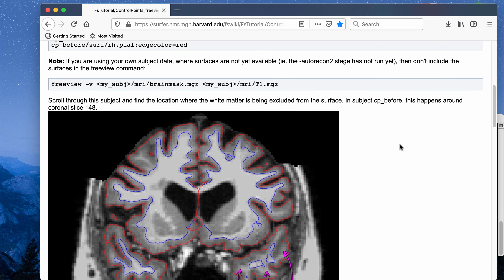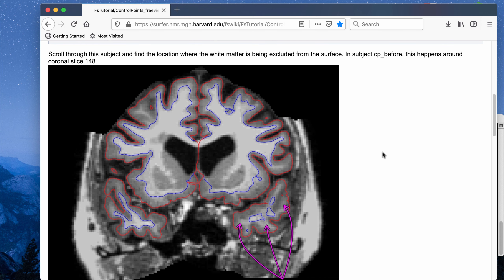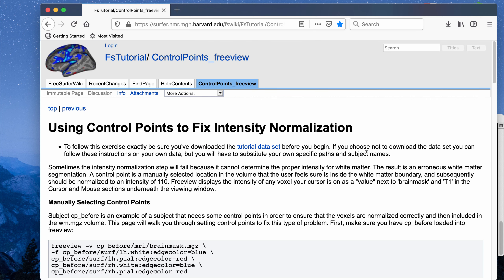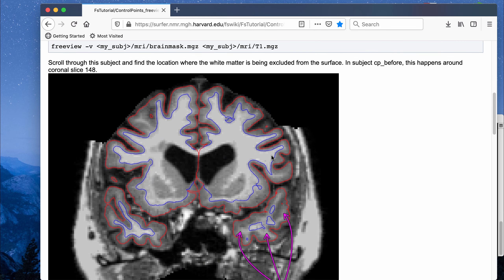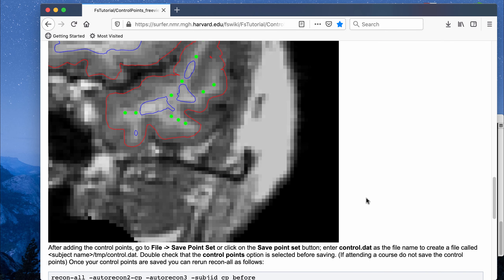After you run auto recon-all, you want to go back in for all of your subjects and do manual corrections. The first manual correction you should do is pial editing — make sure the red pial boundary is correct. Then after correcting the pial boundary, you go in and manually correct the blue white matter boundary. Control point editing is a method of intensity normalization and one way of correcting the blue white matter boundary.